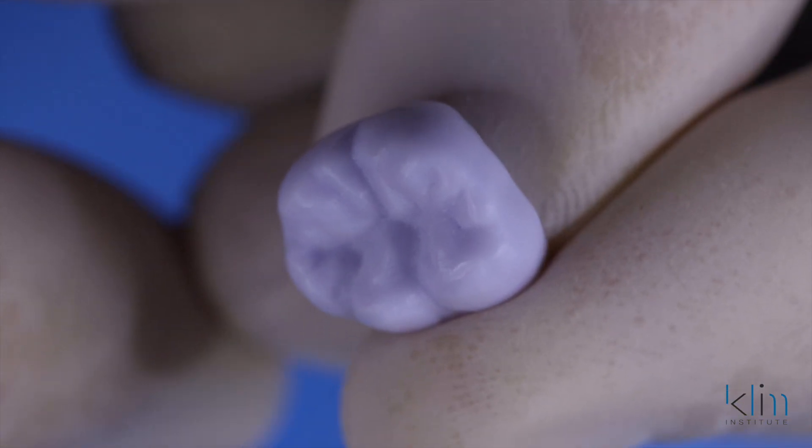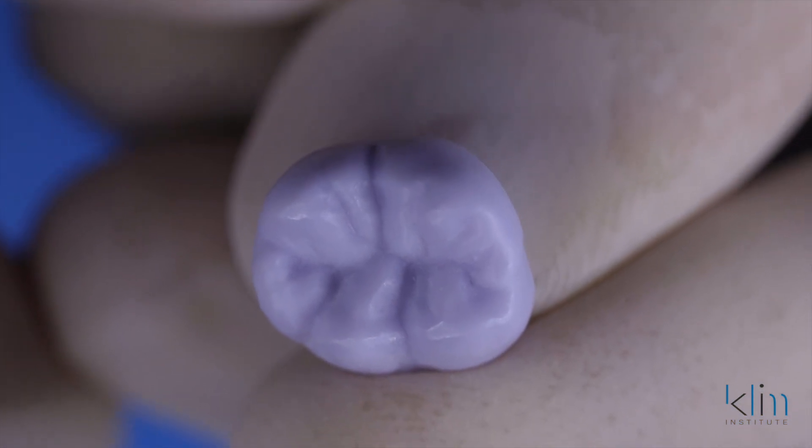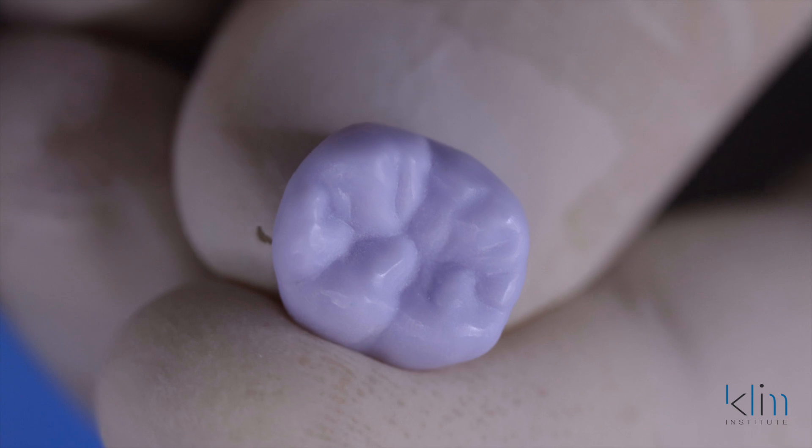Here's a nicely shaped, sculptured morphology and now we're ready to add some glaze. I love the craft of just shaping in restorations — it's a skill set, it's a craft. You have to make it work for you. Once you build your skill set you can apply it anywhere in dentistry, and that's just something that you have inside yourself that you give back to your patients. The videos that follow will cover the various techniques we use for staining and glaze, whether it be brush-on or spray glaze. If you have any questions or comments, make sure you post them below — I love to hear your response and I will respond back to you. Talk to you folks later. Bye!